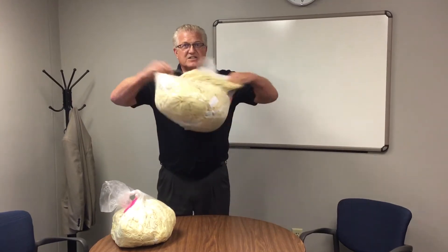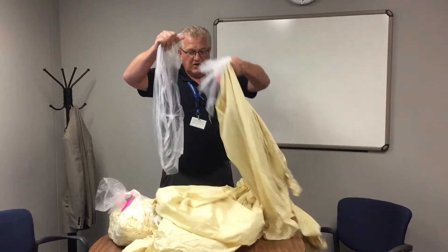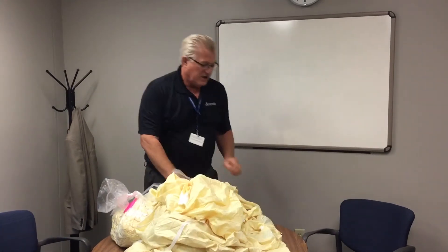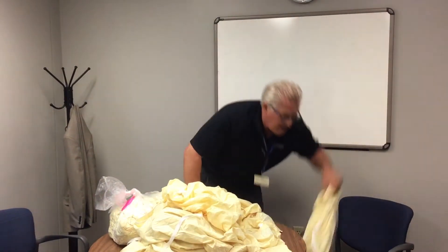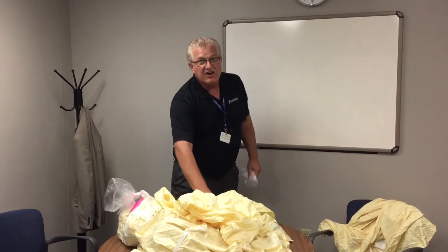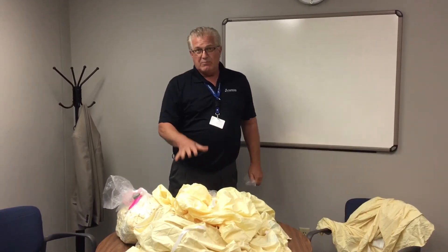This is the wrong way to open up a pack of isolation gowns. You'll notice that when you open it up the gowns fall over. If you're using them in a cart they'll never stay on the cart in the linen room. The same with the shelf.